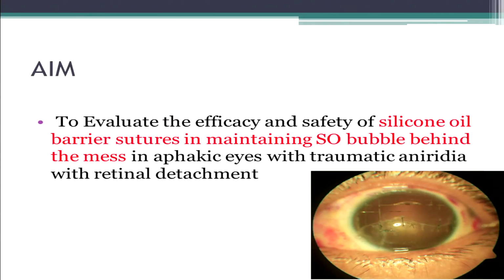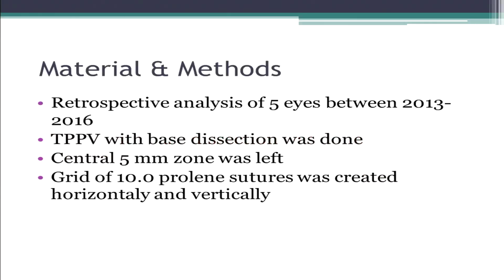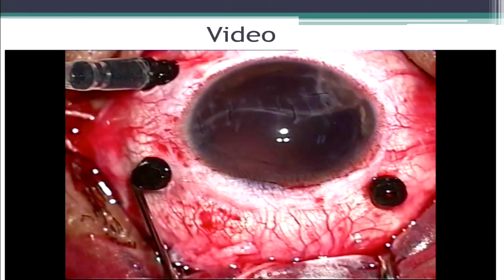The aim of the study is to evaluate the efficacy and safety of silicone oil barrier sutures in maintaining the silicone oil bubble behind the mesh in aphakic patients with traumatic aniridia with retinal detachment. It's a retrospective study of 5 eyes between 2013 and 2016. First, vitrectomy with base dissection was done. A central 5mm zone was left. A grid of 10-0 Prolene sutures was created horizontally and vertically. We'll see how. Please put on the video, please.